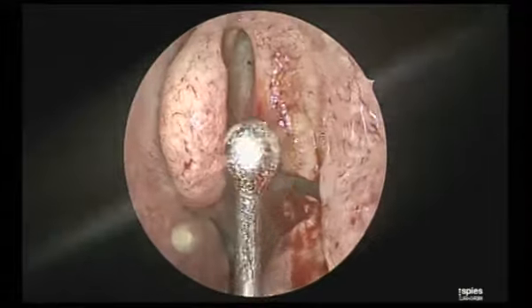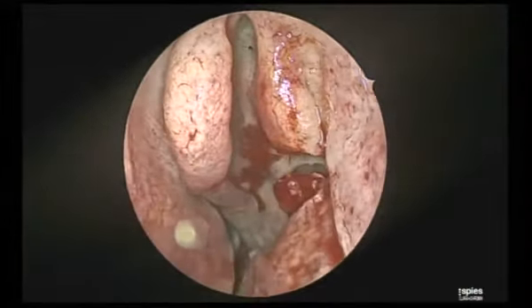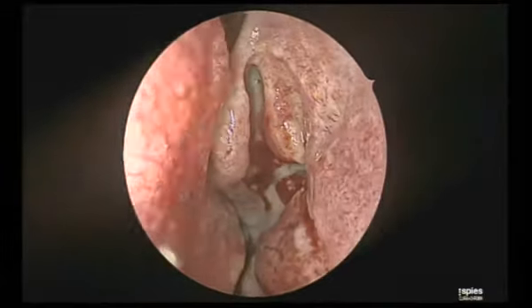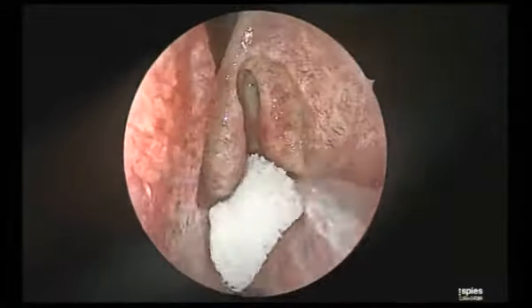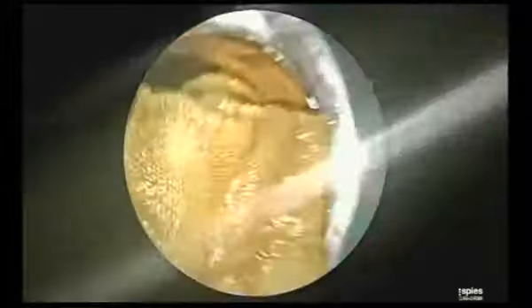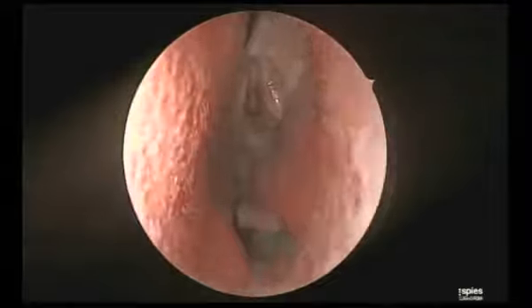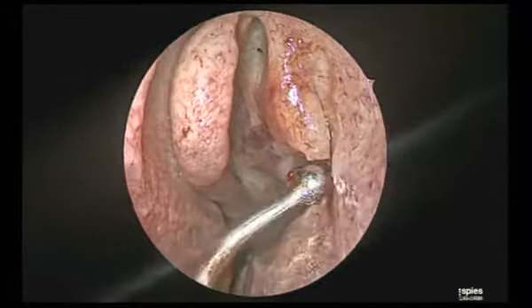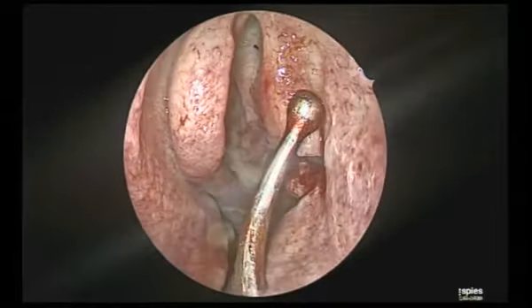Now see, this is the upper part of the uncinate. Whatever I am showing, ours is a training center where a lot of junior trainees come, and we give them hands-on surgical experience as well. So the technique I am going to show is the most simplified version of sinus surgery, not for the sake of showing off what you can do. This is simplest. So this is the upper part of the uncinate.